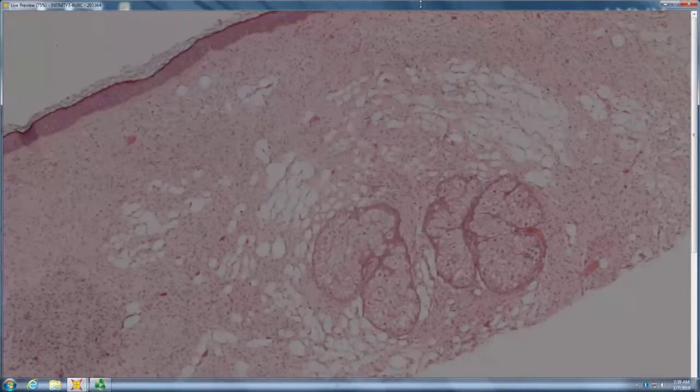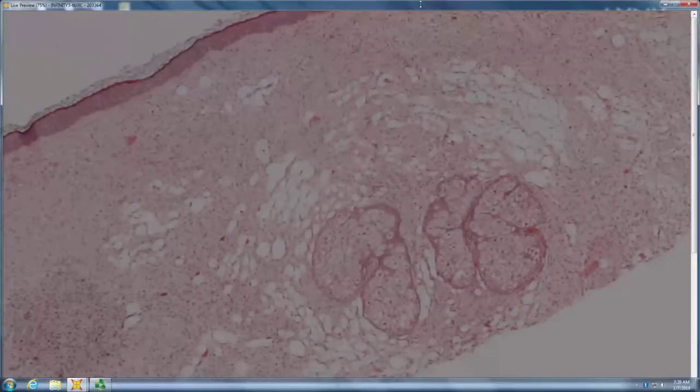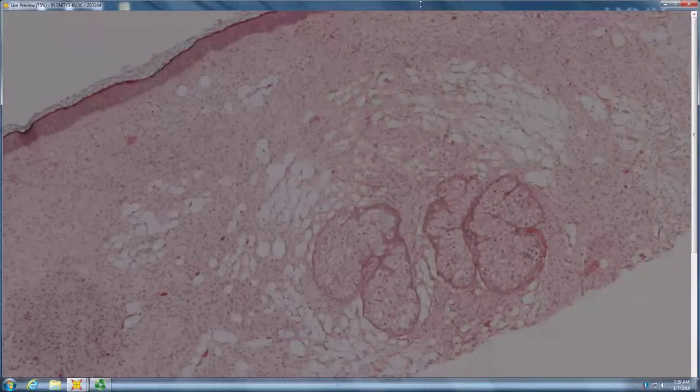Either fat cells, which you can occasionally get in senescence, there are neurolipomatous hamartomas, but they usually have mature nerve in them. You can get fatty change in an old neurofibroma. Sometimes it's also that those aren't real lipocytes. It's a fake out. It's just blebs from the xylocaine that you pumped in too fast.